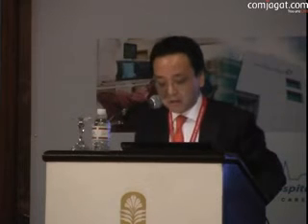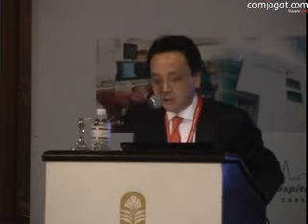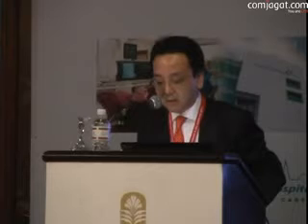For stent thrombosis, we start to see significance. There's about a 30% relative risk reduction with the second generation everolimus stent versus the first generation stent. Also for target lesion revascularization, although it's not statistically significant, we definitely see a trend that favors the second generation DES versus the first generation DES. Also for the composite MACE, the second generation fares better.